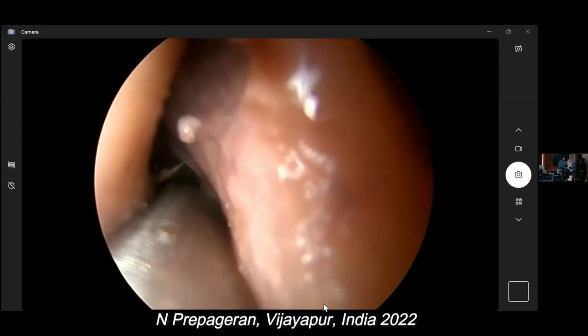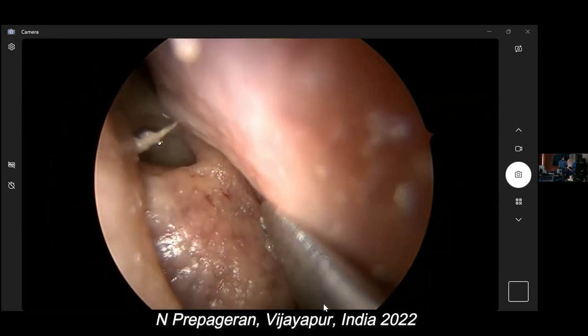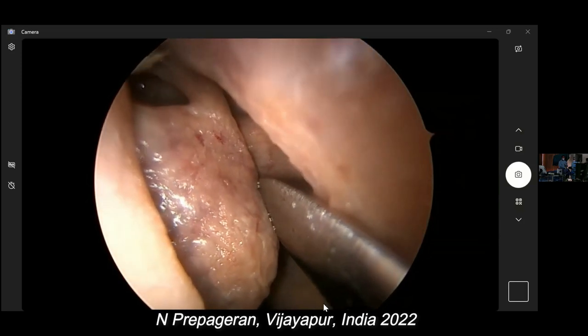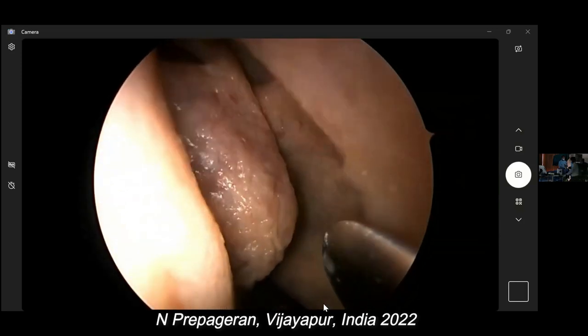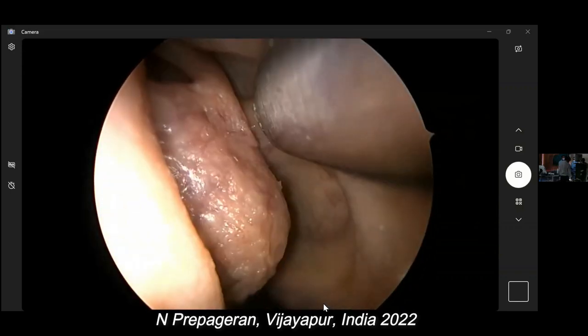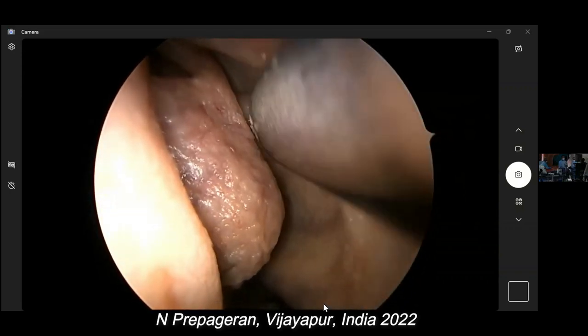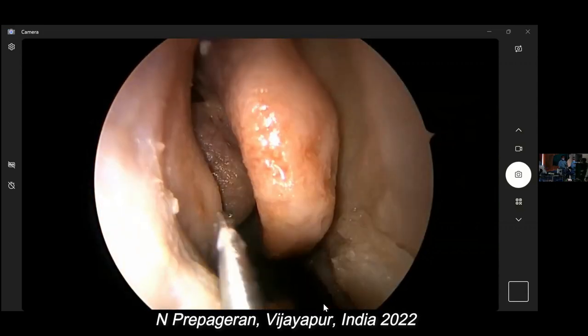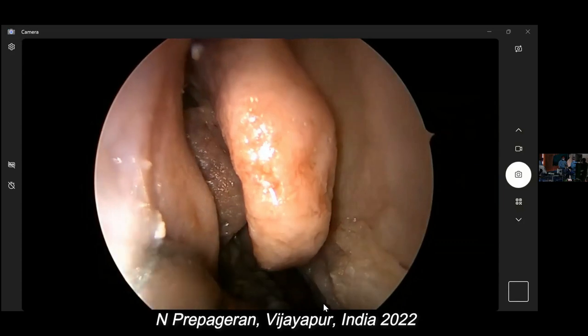In this case, if there's an air cell above, it's a suprabulla air cell. If there's an air cell behind this, it's a retrobulla air cell. And if the middle turbinate turns laterally like that, this becomes your ground lamella. That's the vertical segment. That's the horizontal segment. If you remember the gates, then the dissection becomes very easy.